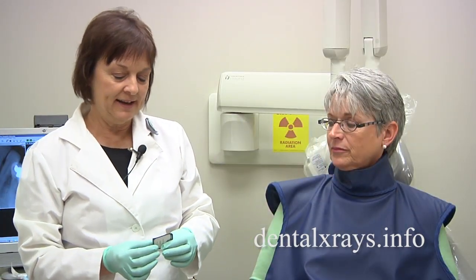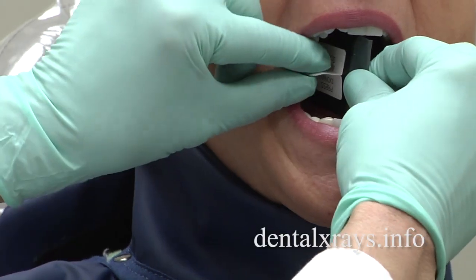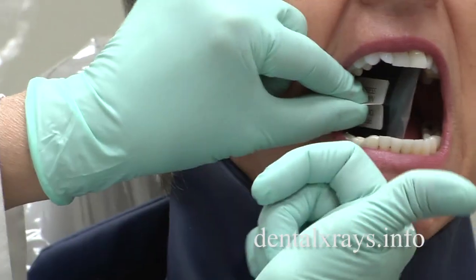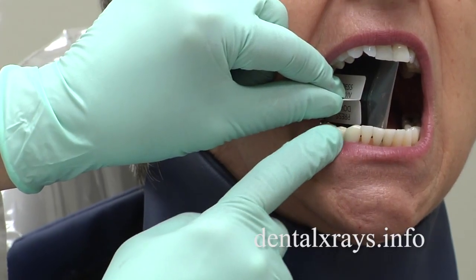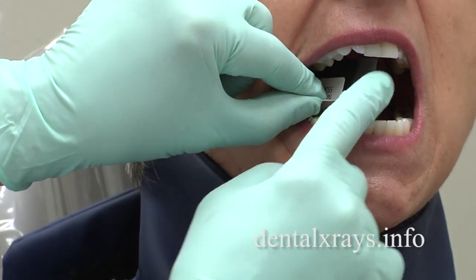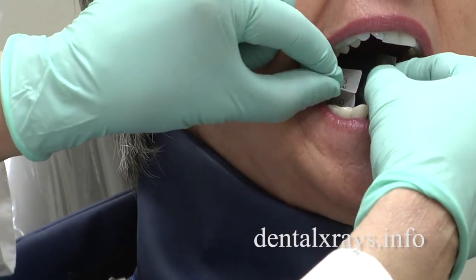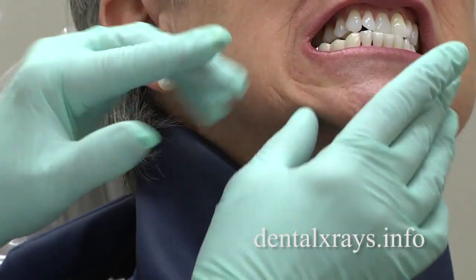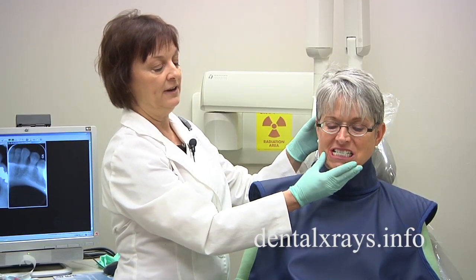The other part of bisecting angle is your bite wings. If you use a bite tab, place the film to include the premolar. Make sure your film is far enough forward in the mouth — right behind those front teeth — so that you're including the space between the canine and that first premolar. If you can't get it forward enough and this tooth isn't in front of the film, you'll need to wedge it slightly to the side, then have the patient close. For bisecting angle, you don't want them sitting with the occlusal surface tipped up, so just bring the chin down and work with the angles you need with the tube.